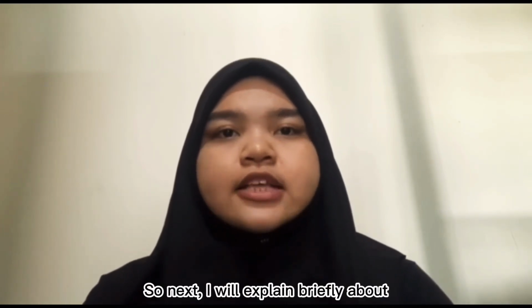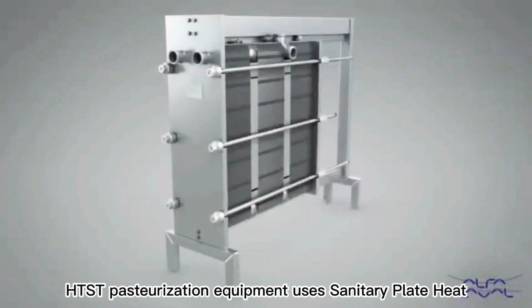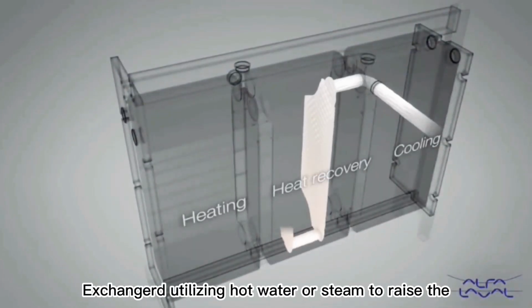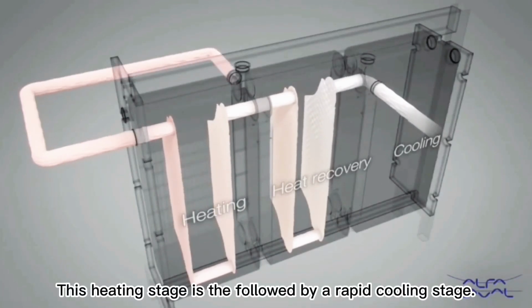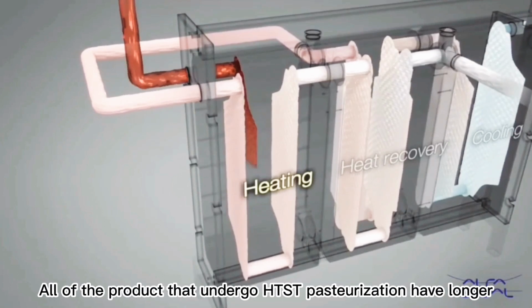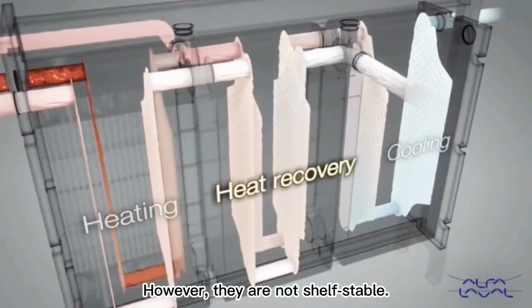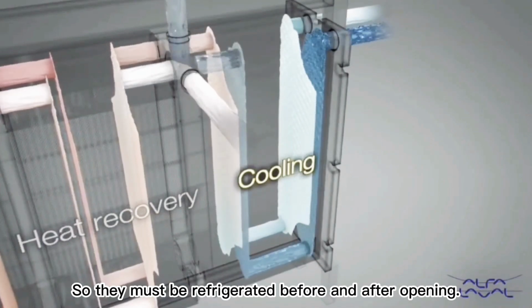Next, I will explain briefly how the high temperature short time pasteurization system works. HTST pasteurization equipment uses a sanitary plate heat exchanger utilizing hot water or steam to raise the temperature of the product. This heating stage is followed by a rapid cooling stage. The pasteurization temperature and time depend on the products. All of the products that undergo HTST pasteurization have a longer shelf life than their unpasteurized counterparts. However, they are not shelf stable, so they must be refrigerated before and after opening.